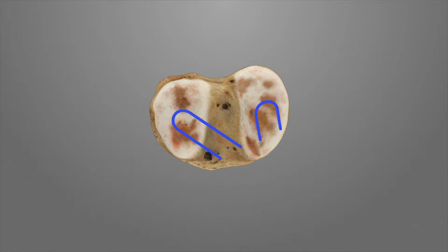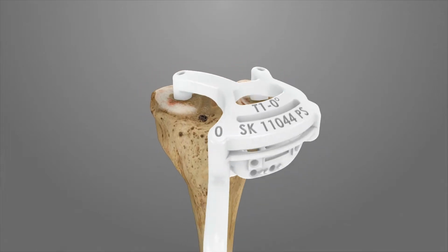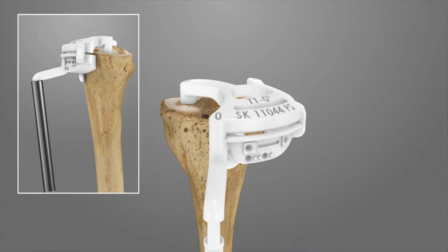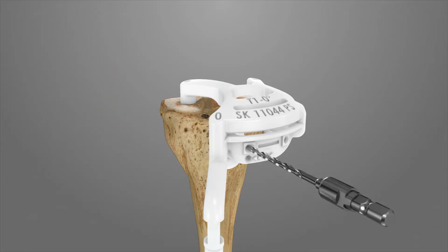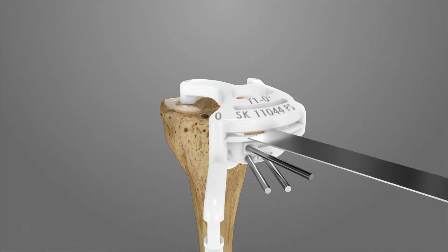Using a scalpel or curette, remove any cartilage or tissue left within the marked lines. Next, place T1 back into position on the tibia and verify alignment by attaching an alignment rod. The alignment rod should point distally to the center of the malleoli and should be in line with the tibial mechanical axis in the coronal plane, as well as parallel with the tibial mechanical axis in the sagittal plane. Once T1 is in proper alignment, drill and pin T1 into place through the two parallel holes and at least one of the two crosspin holes. Complete the tibial resection.